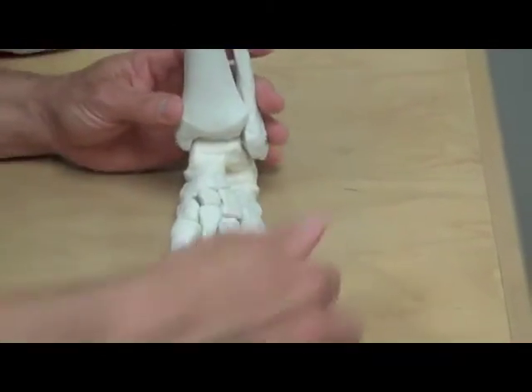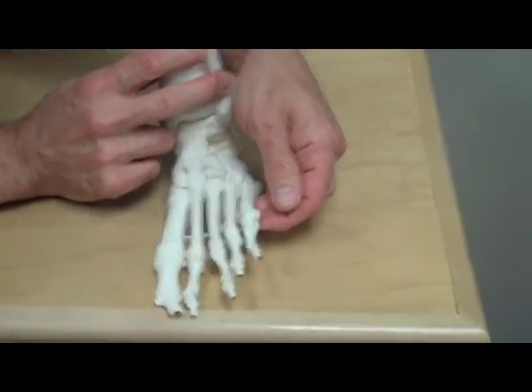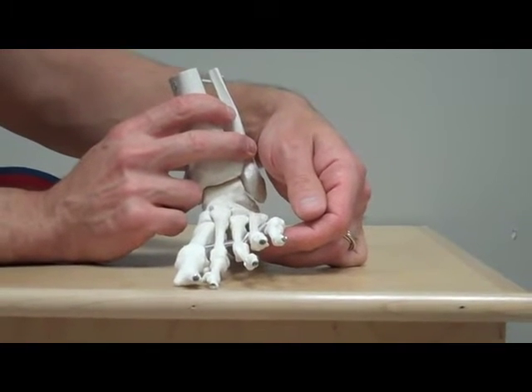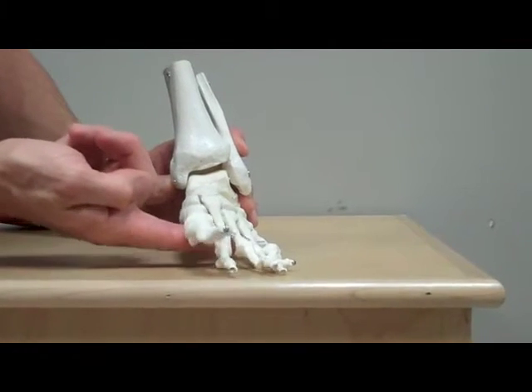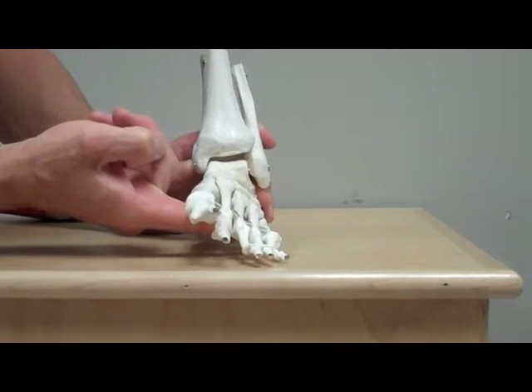We're trying to, in a sense, keep this higher over here and keep the big toe lower relative to it. Okay, we call that a valgus post or a lateral post versus a medial post or varus post is something that does more like this, keeps the big toe higher.